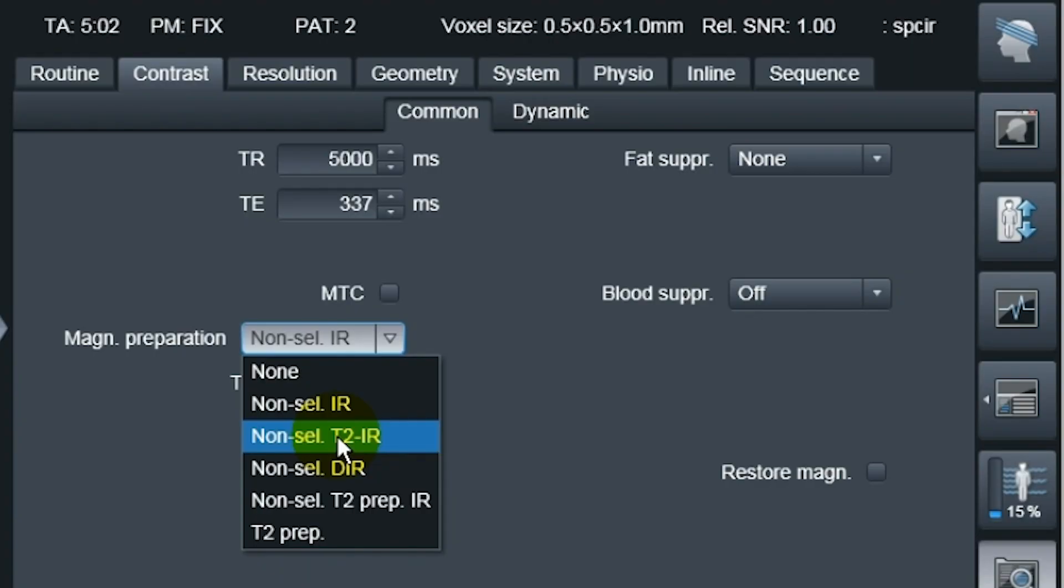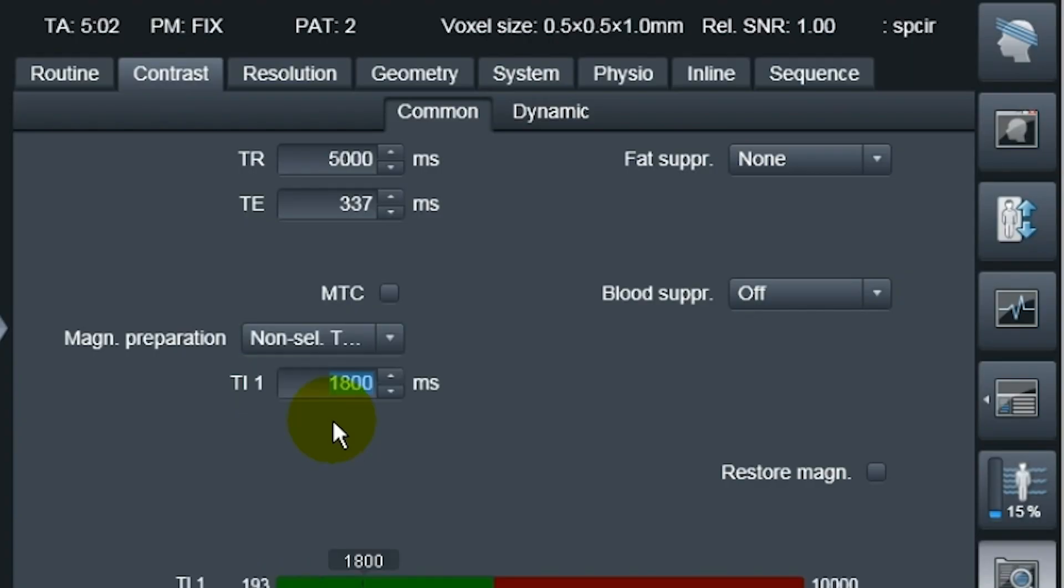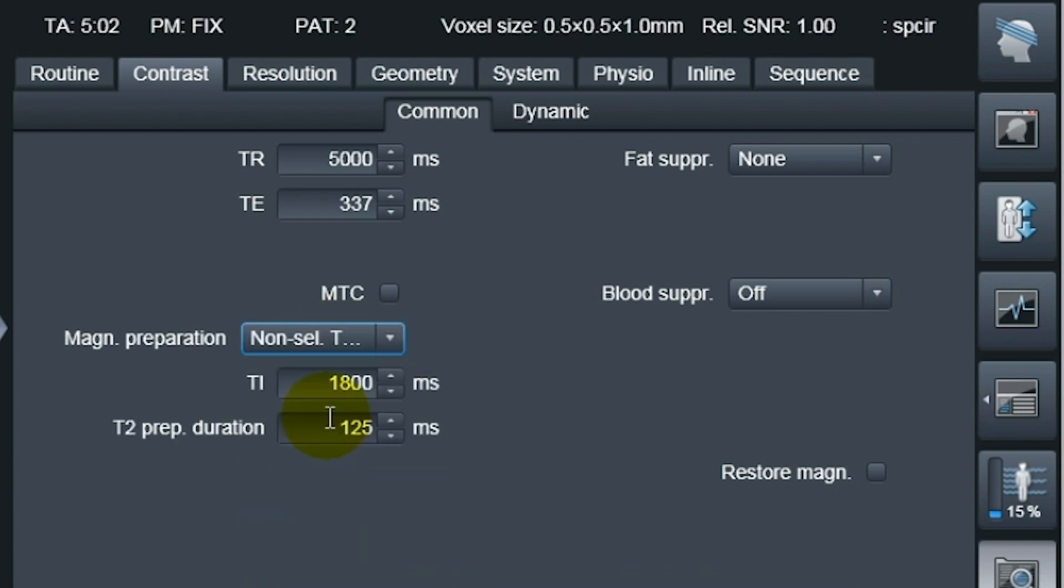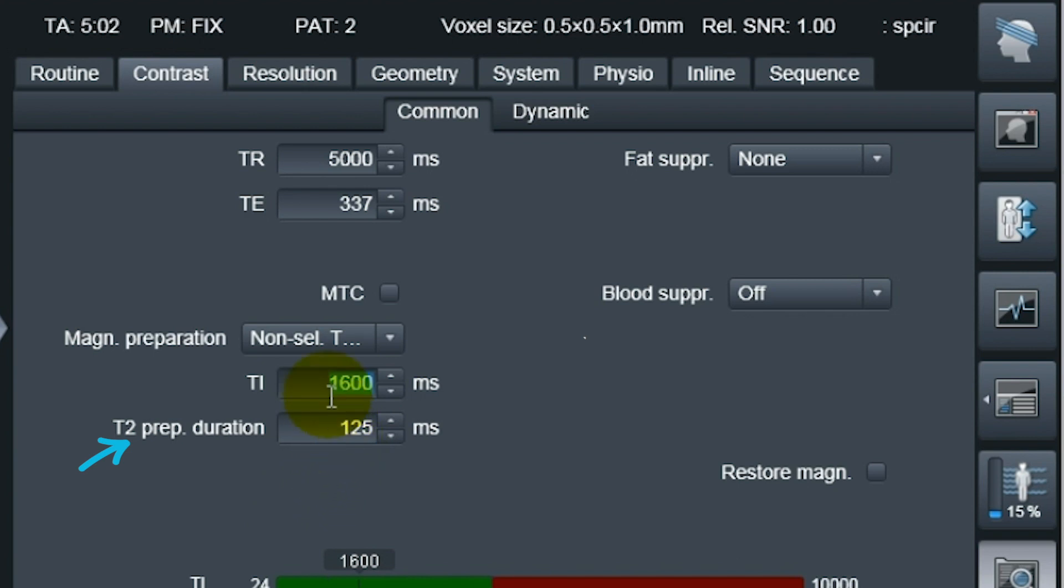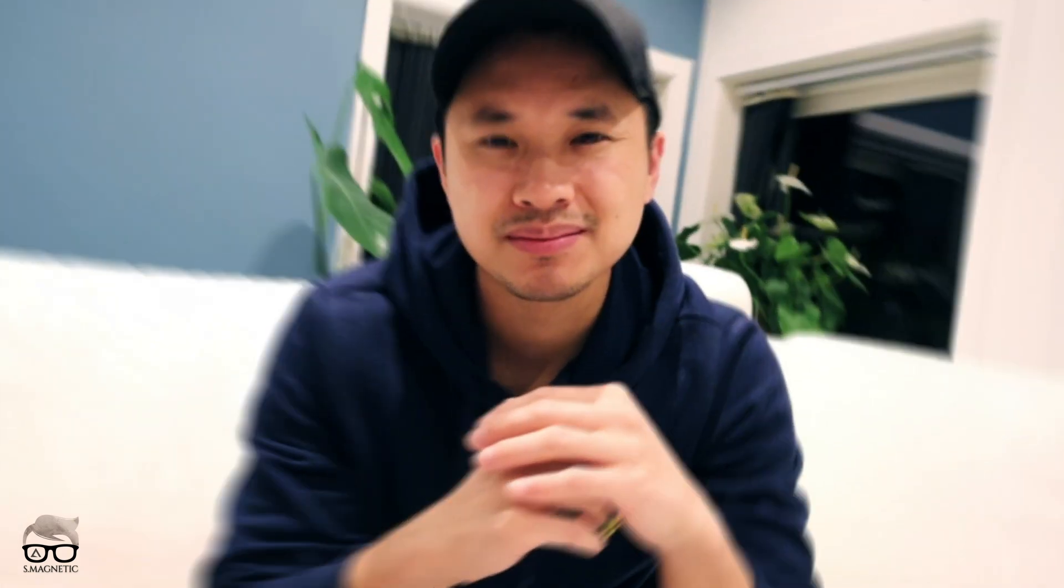I also noticed that there's changes in the TI time. Whenever you have a TR of, let's say, 5000, with the old pulse non-selective T2 inversion recovery, it usually would be around 1800 milliseconds. But now it changed it to 1600 with the prep pulse. So this is different, but the images look also different. With enough said, let's go to the scanner and check it out.